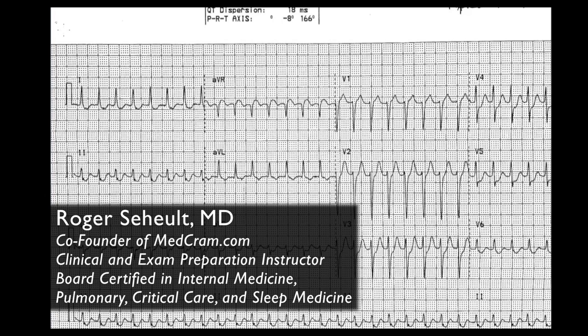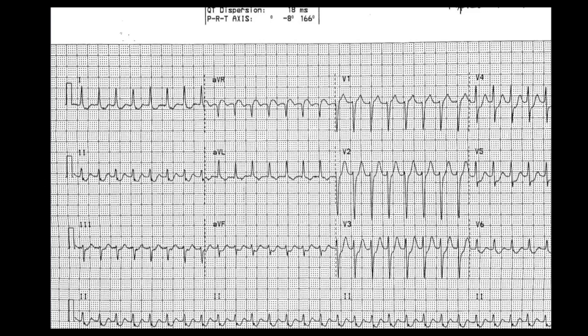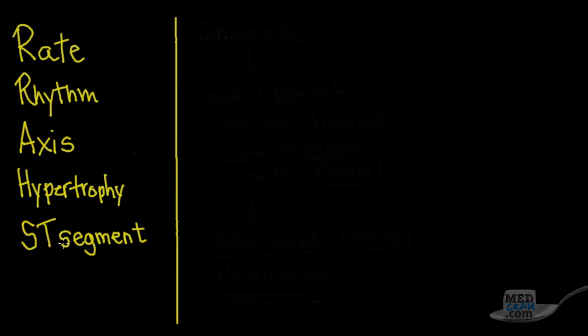Here we've got our next EKG, which we're going to talk about. We're going to go through this in a methodical fashion using our tried and true technique of rate, rhythm, axis, hypertrophy, and then looking for ST segments.